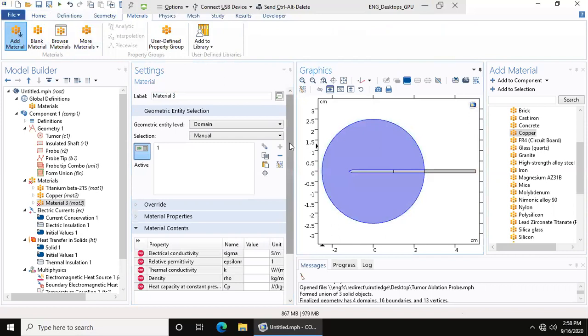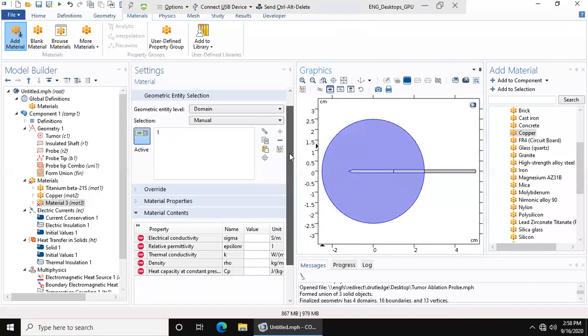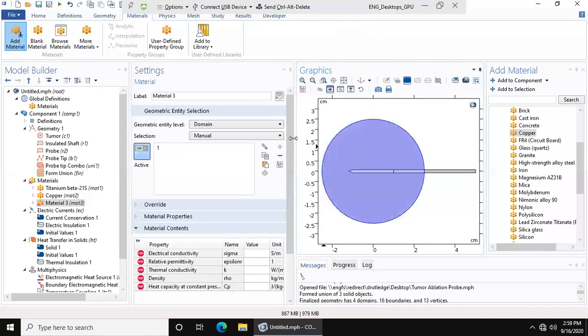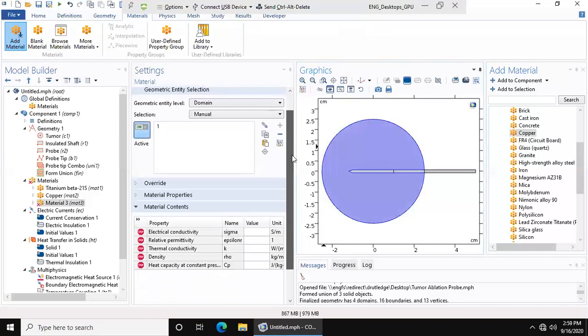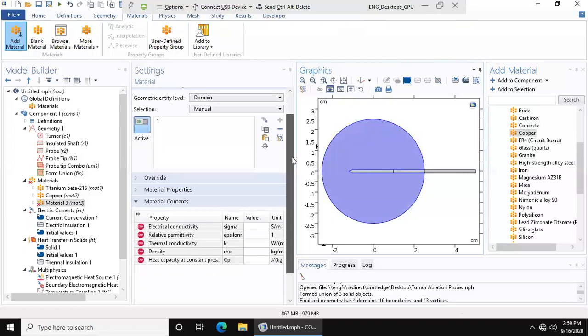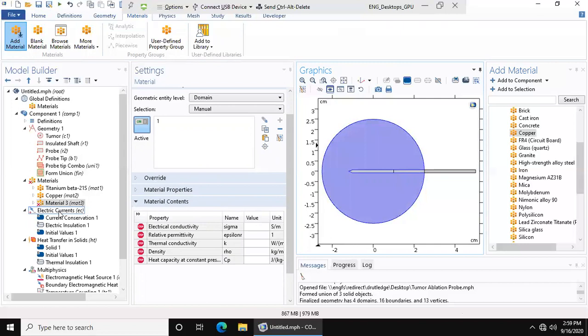When you make a blank material, it doesn't know what properties you want. So you choose this tumor, and you have this geometry associated with this physics. So we know what properties you need for this physics, therefore we know what properties you need for this geometry. It has all the properties that you need to enter for the model to work right here.